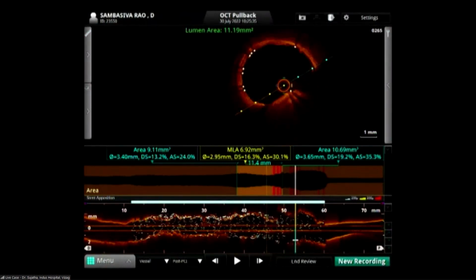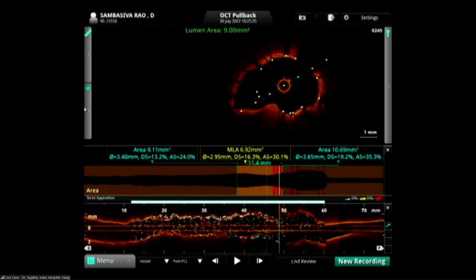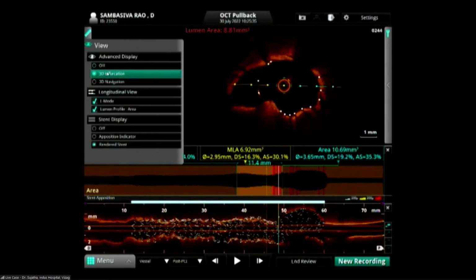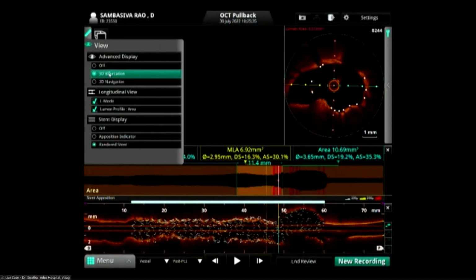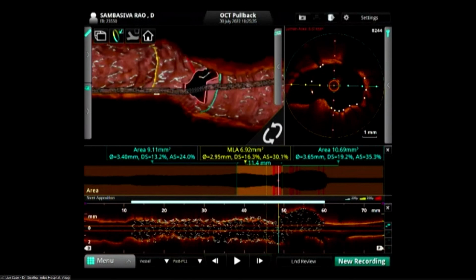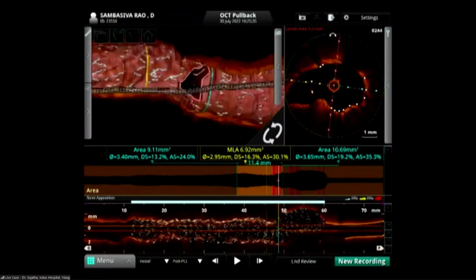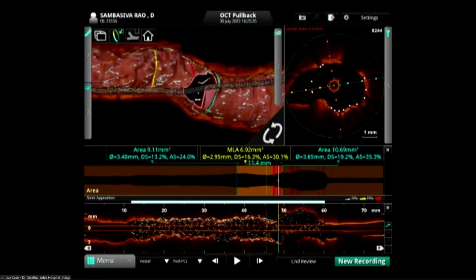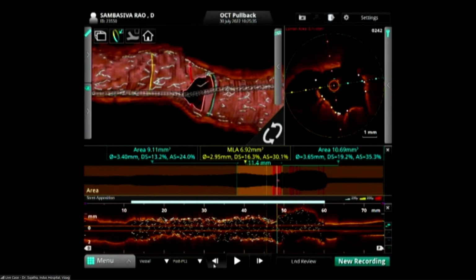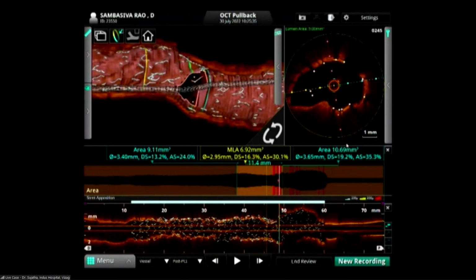Any final comment? We just want to show the stents across the circumflex. Okay. Can you show the 3D view, because my strategy is to look at the struts across the circumflex and do something only if there are any struts across the circumflex. It's beautiful. Otherwise, imaging helps us do this. Also, in bifurcation lesion, fortunately, there are not many struts. Only one thing which is seen on the opposite side. I think a perfect demonstration of LCx ostium by OCT again. That's the beauty of this technology.